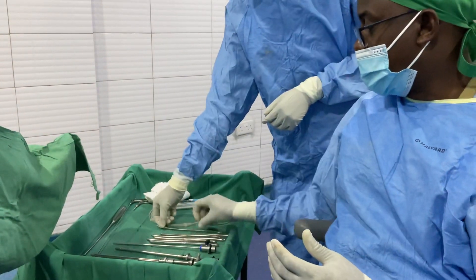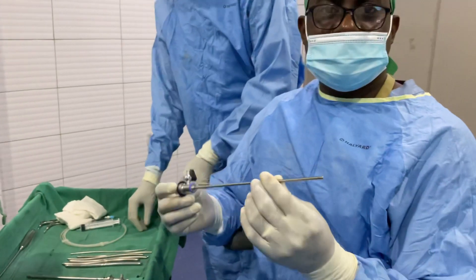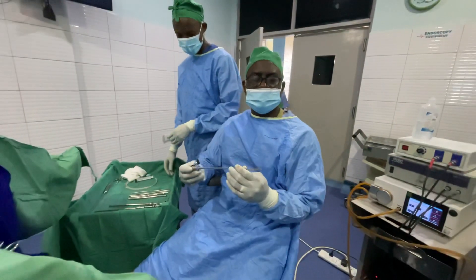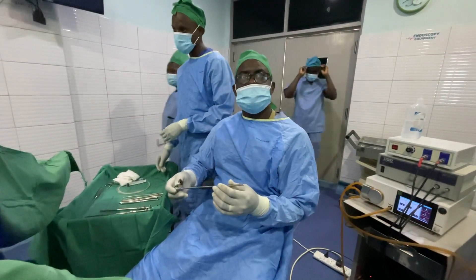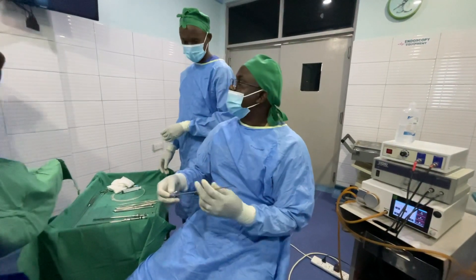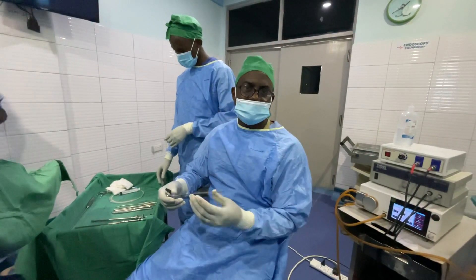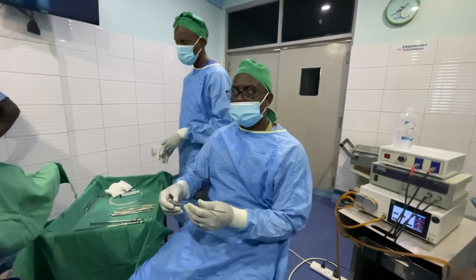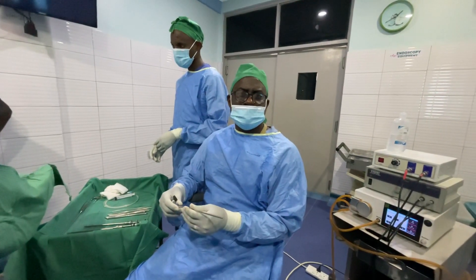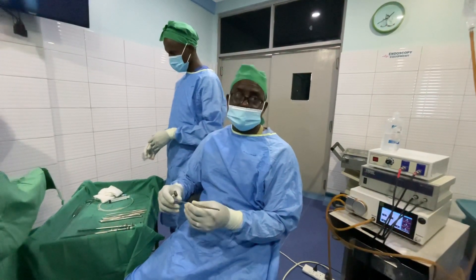If you are going to do a quick diagnostic hysteroscopy you are going to use a single channel sheath, which is about 2.7 millimeters. Sometimes you have a 4 millimeter sheath, which is the traditional hysteroscope, but the sheath can be as small as 1.7. For office hysteroscopy you have flexible scopes which are about 1.7mm, so for that case you don't even need to dilate the cervix. But if you are going to use a scope above 2.7 millimeters then you might need some dilatation.